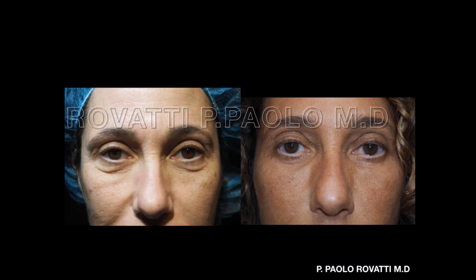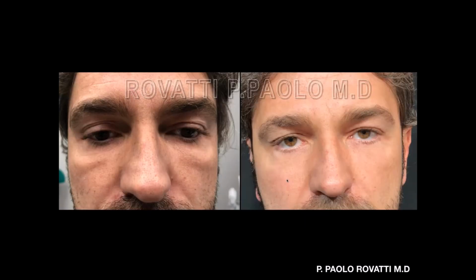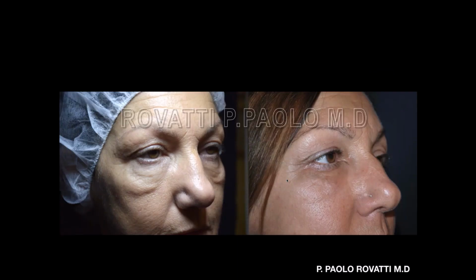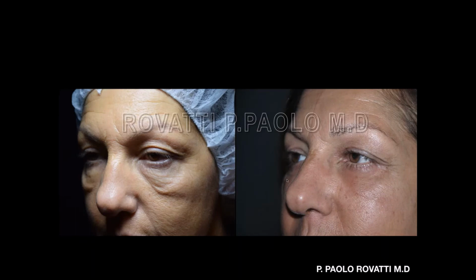This is another patient. You can see on the left, there is a big malar edema, a big malar bag, and even in this man, you can see there is something like festoons coming, and this is a great result. Look at this one, it is great, absolutely great, even this patient. So sometimes I treated with high focused ultrasound, and I had some results, but the idea was, well, start with some more heating, more heat, and so we have this result. So this is good.